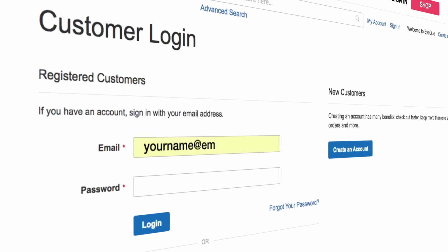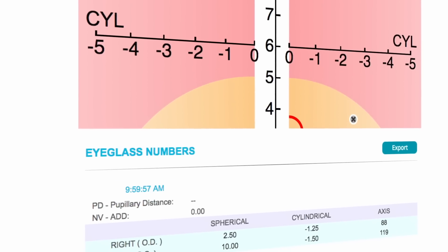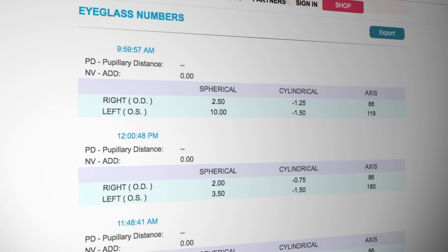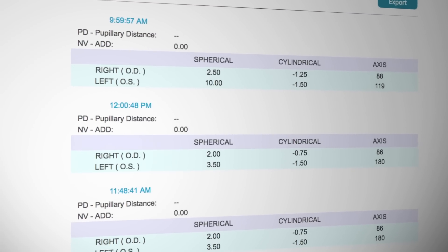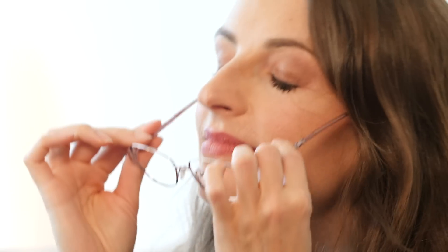With IQ, your test results are securely stored online at IQ.com in your personal dashboard. Like never before, you can compare your test results with previous tests, creating a vision history that can be shared with your eye doctor. Now, thanks to VisionCheck by IQ, you're seeing better sooner.